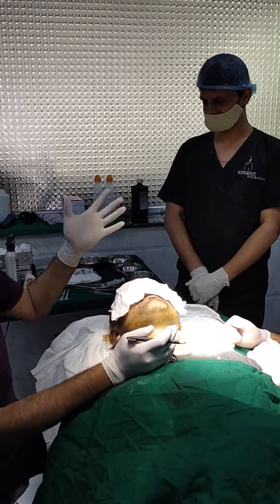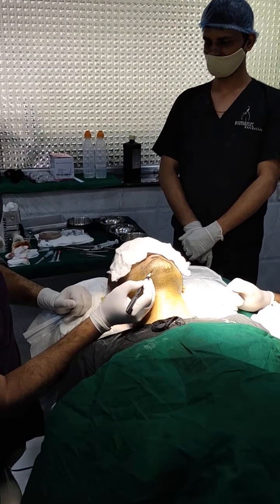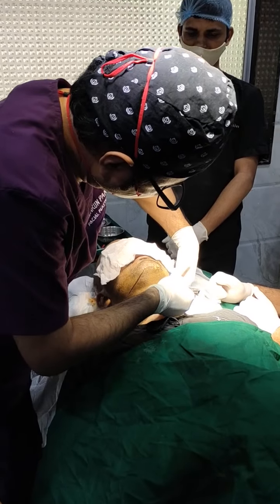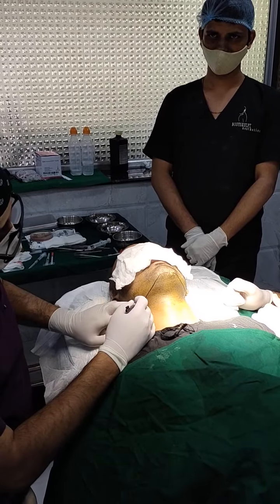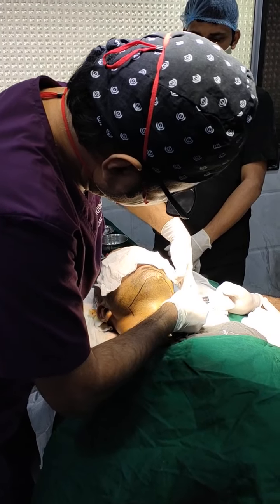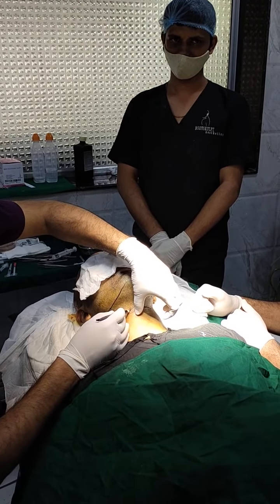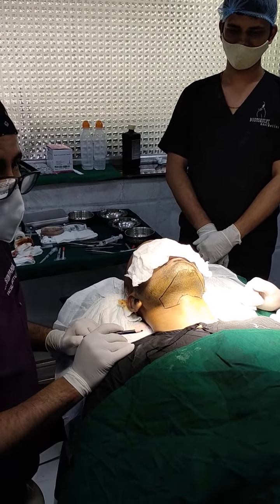Now I'll mark and show you which areas we are looking at. What you do is draw a line along the lower border of the mandible, all the way here, and here, here, and the lower border here. So this is going to be our upper extension, okay? And then when we go laterally, go down here like this, and you palpate the thyroid cartilage, go around here, okay?